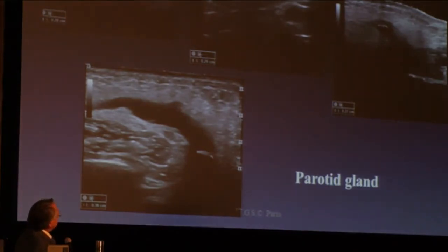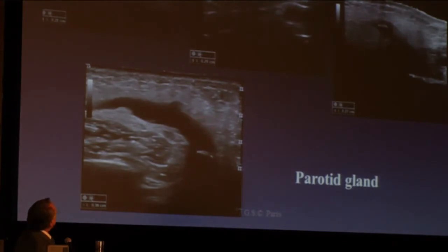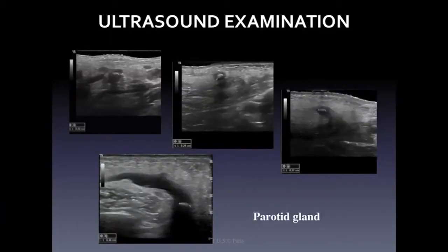So you see here, it's like all the ultrasound. You can see the stone, you can see the duct, you can see the dilatation, you see the parenchyma, you see everything with the ultrasound. No radiation, nothing.